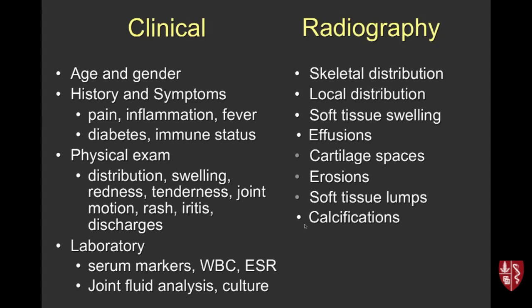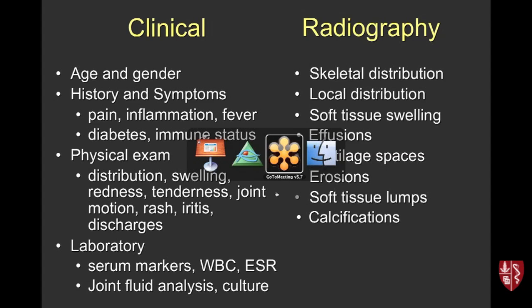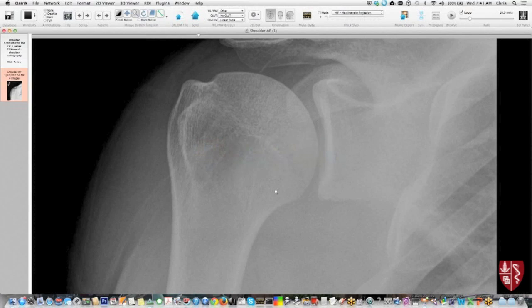So when I'm looking at arthritis cases, these are the things that we're focused in on. And we have this as the backdrop, hopefully more of this than less. But that's basically the key background that I want you to take away. So let's take a look at some cases here, and we'll just buzz through a number of cases fairly quickly.